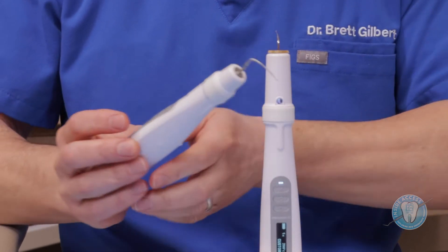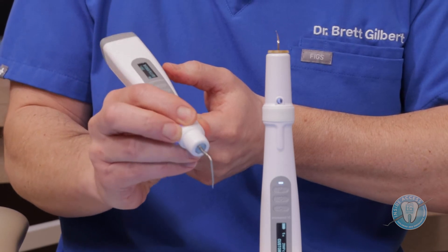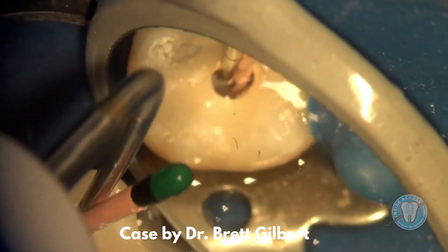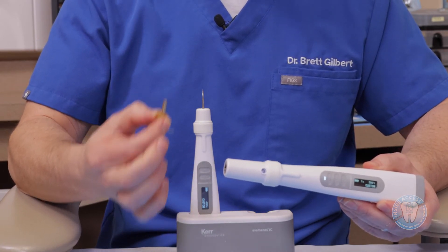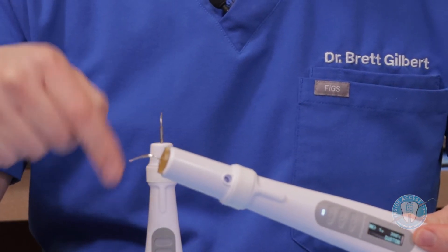The tips lock in, so they're nice and stable. It has the 360 touch, so no matter where you grab the unit, you can activate it by just pressing the button. You have a couple of different heat options — I like that it has the opportunity to go up to 400 degrees Celsius. It's very nice for your downpack warm vertical or warm condensation type techniques. You just drop it into the cradle and it automatically charges. For the backfill device, it also has a removable cartridge which has the gutta-percha inside it, so no gutta-percha actually goes inside the unit itself and there's really no maintenance needed.